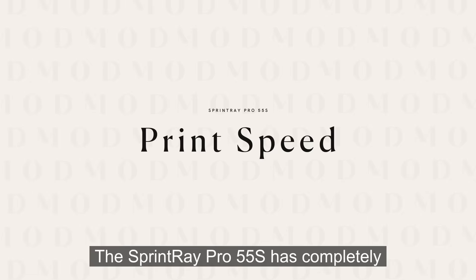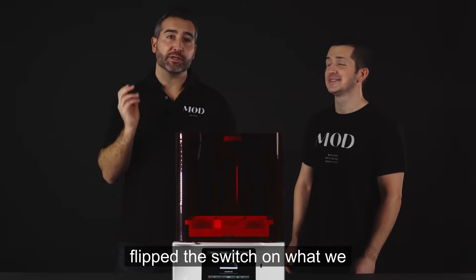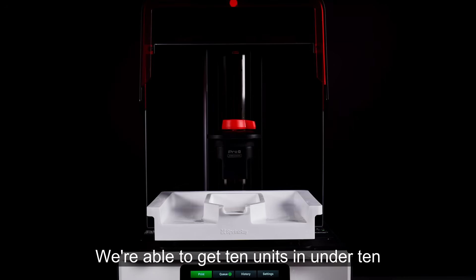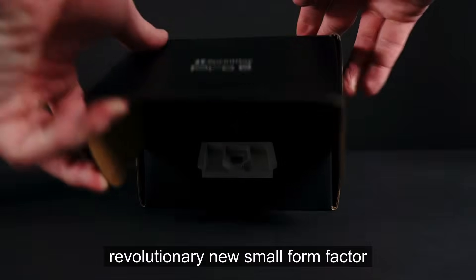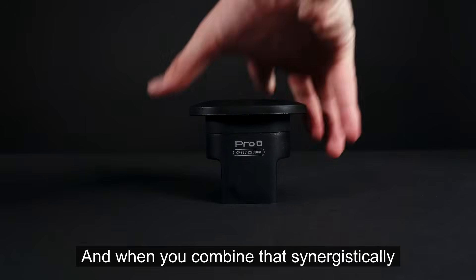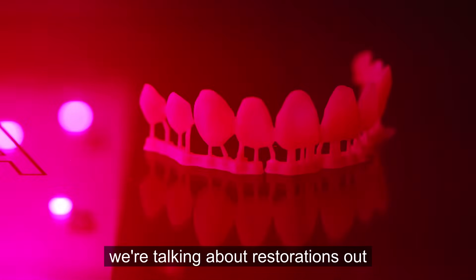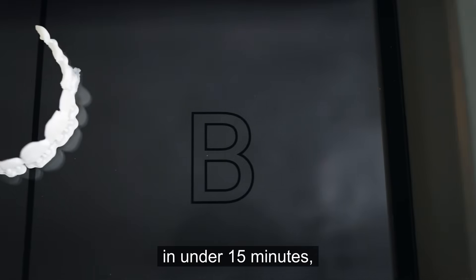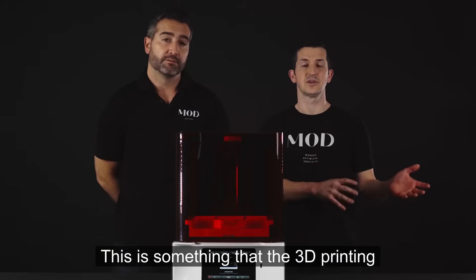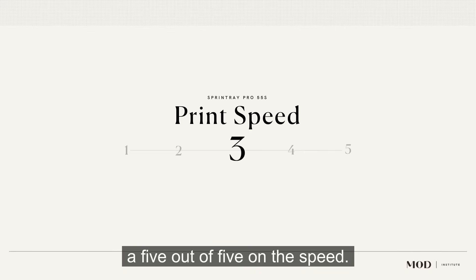The Sprintray Pro 55S has completely flipped the switch on what we consider to be a fast printer. We're able to get 10 units in under 10 minutes with its revolutionary new small form factor build plate with internal heating. When you combine that synergistically with the fast Pro Cure 2, we're talking about restorations out in under 15 minutes, completely processed and ready to go. This is something the 3D printing chair-side market has just not seen yet. We're going to give it a five out of five on speed.